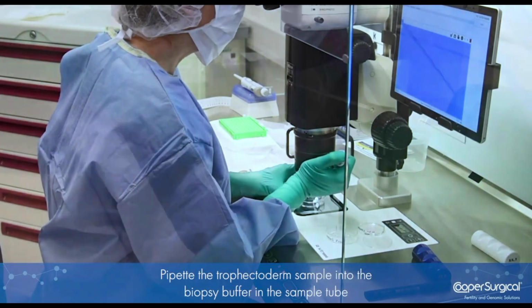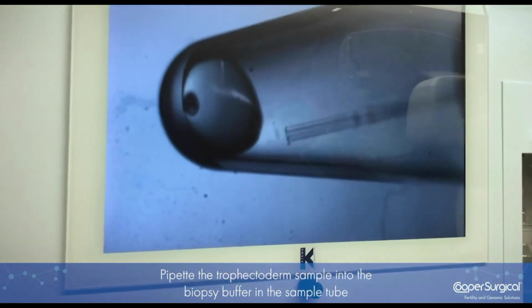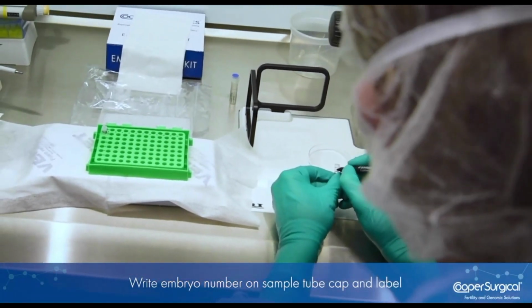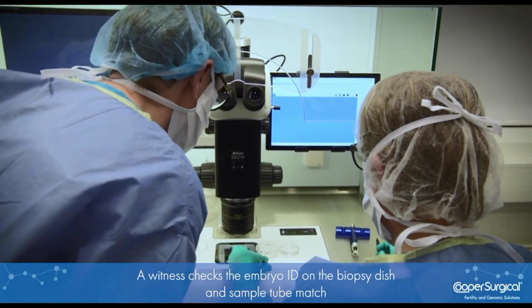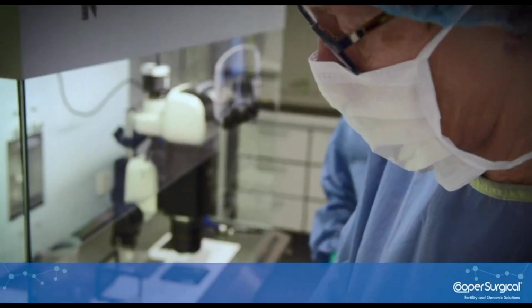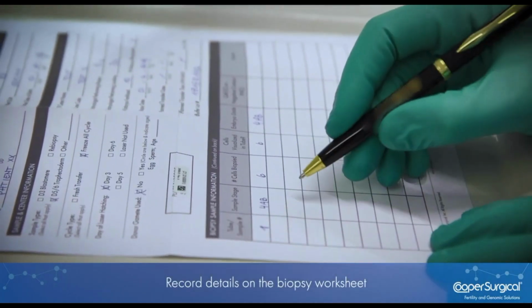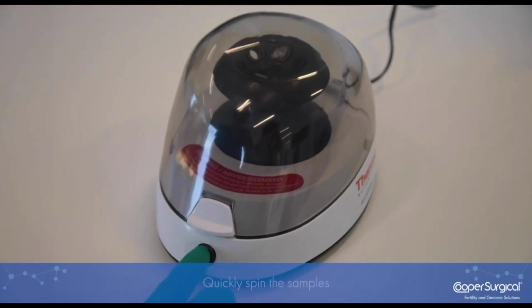We are focusing now on the tip of the tube, and we will introduce the pipette and deposit the sample in this 2 microliter of buffer. We will check, flush the pipette to see if the sample has been removed. And then we will write the number of the embryo on the tube and on the label as well. And the witness will check this and will record all other important items, like the number of cells, the quality of the specific embryo, and so forth.